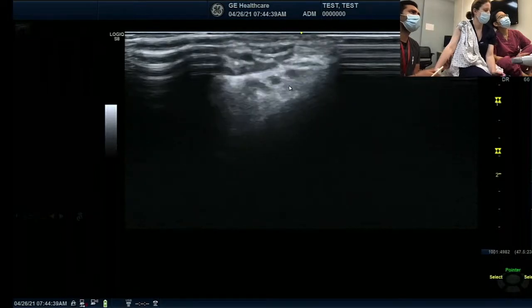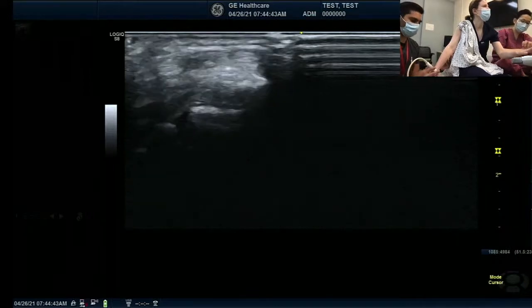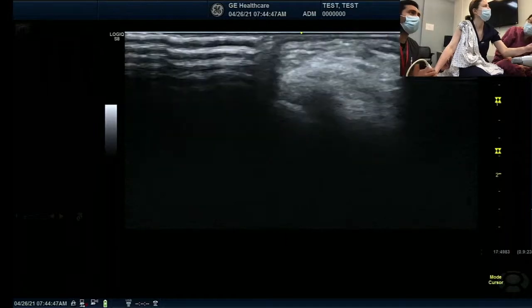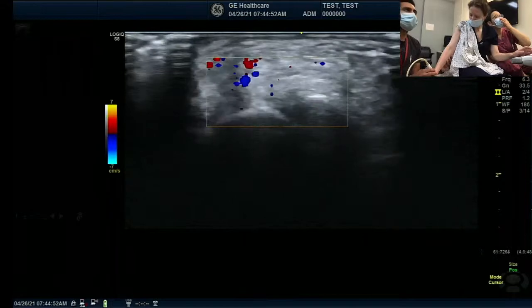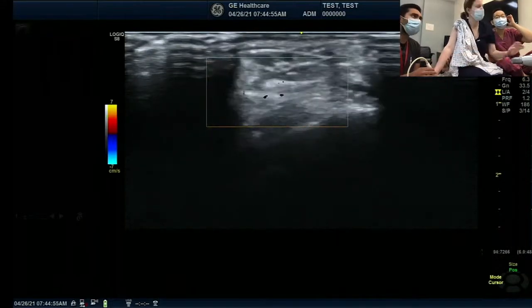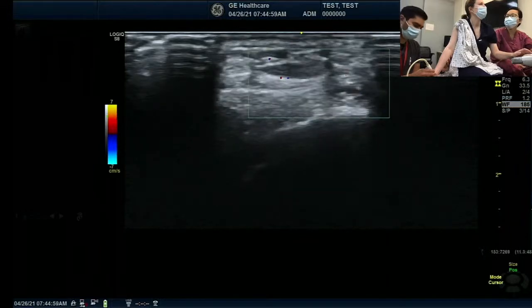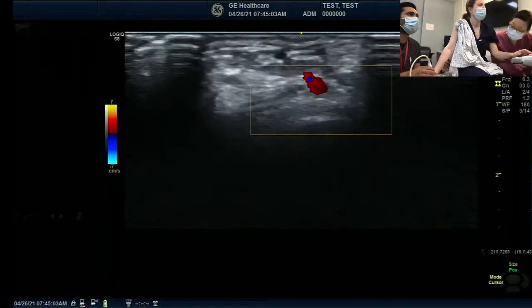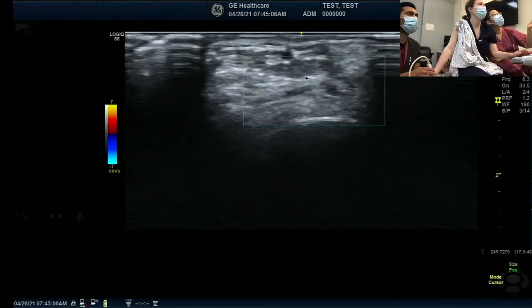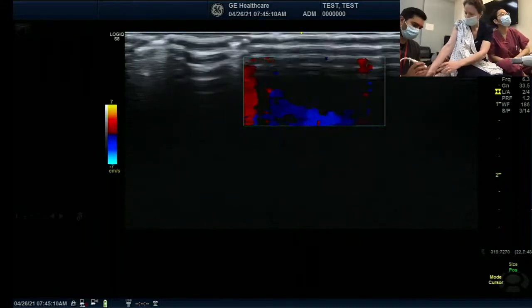Now I can put Doppler, right? Yeah, the cephalic vein. Usually, when the superficial branch comes out to the subcutaneous area, the cephalic vein crosses over the radial nerve superficial branch. So where is it? We're at the snuff box. You have to find the first and second one.